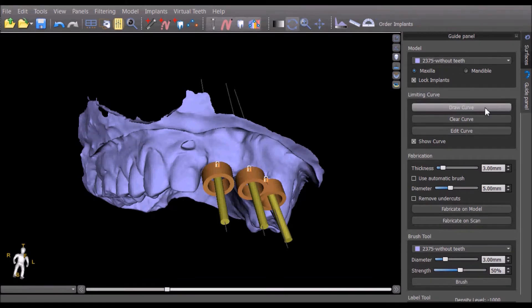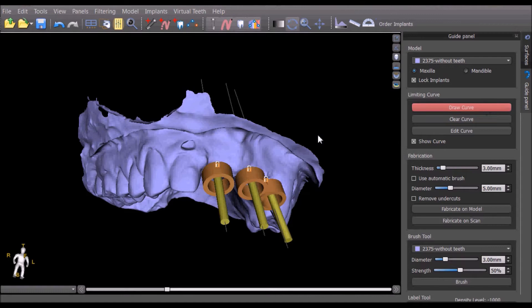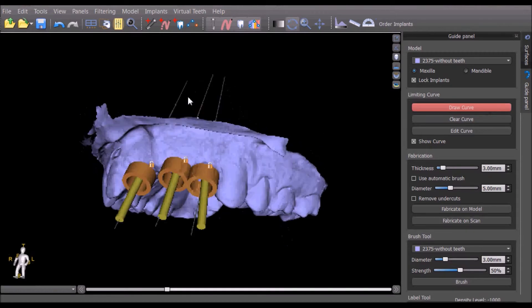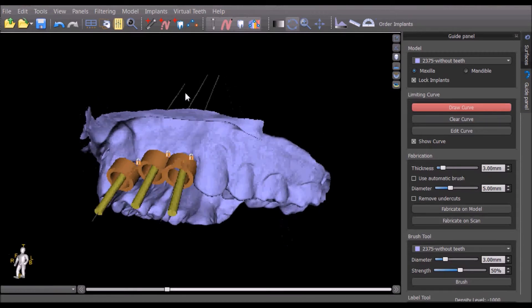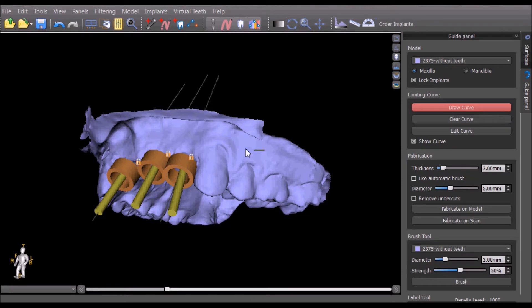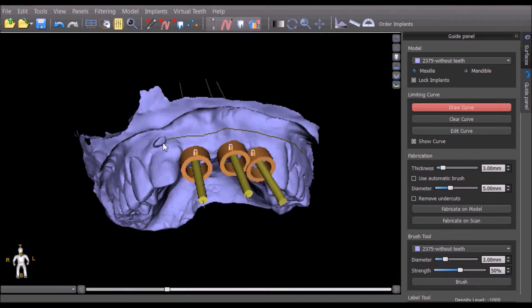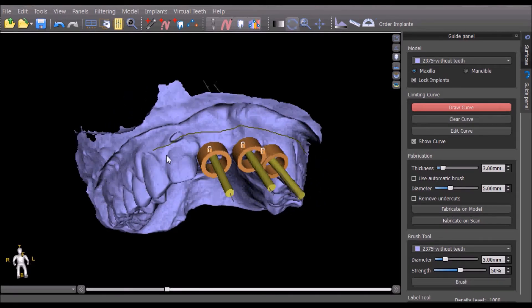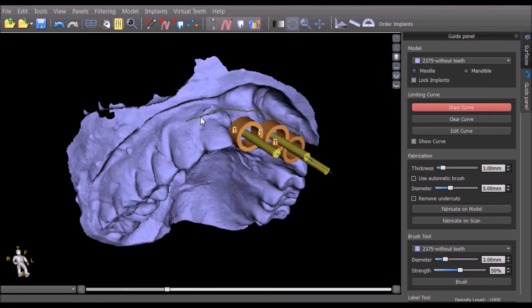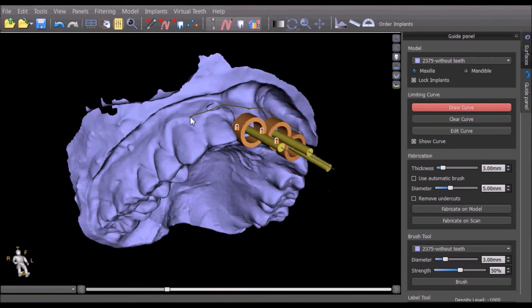The draw curve button turns on the curve drawing functionality. Using the left mouse button and holding down the shift key, we can draw the curve, outlining the shape and size of the surgical template.